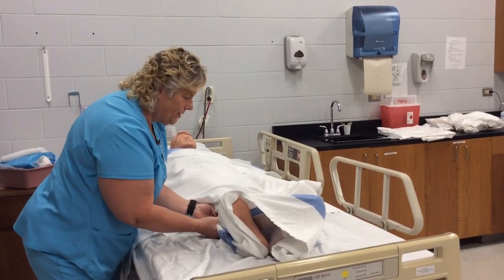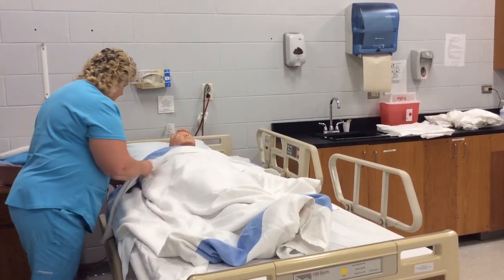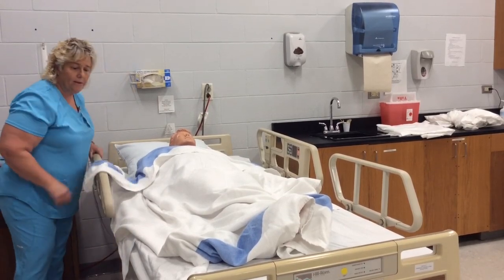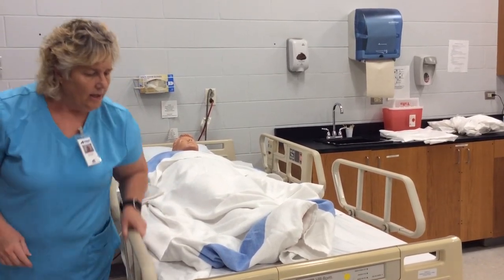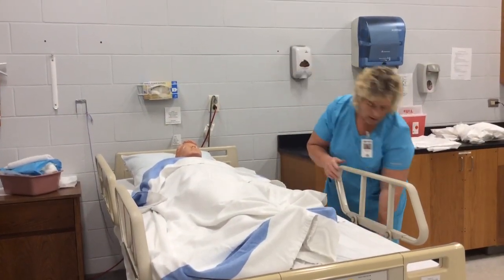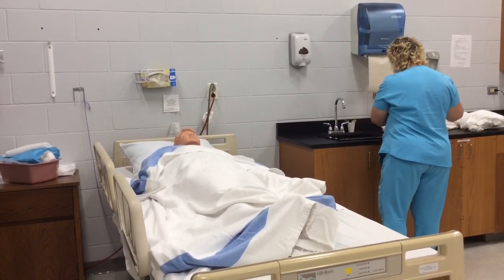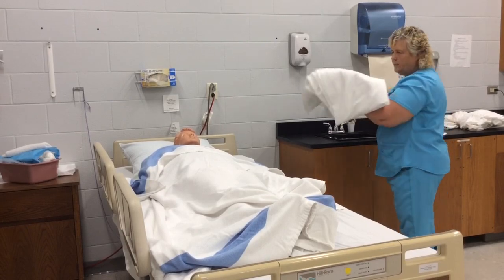You see she's wrapped up here just a little bit, so I'm just gonna lift her leg up and get that fixed. And then I'm gonna put the side rail up because that's a critical step. I'm gonna go to the other side and I'm gonna put my side rail down and I'm going to get the flat sheet.